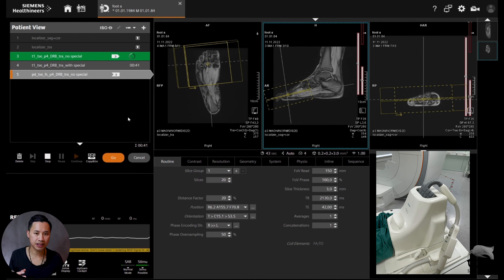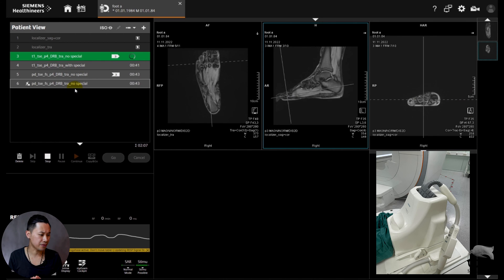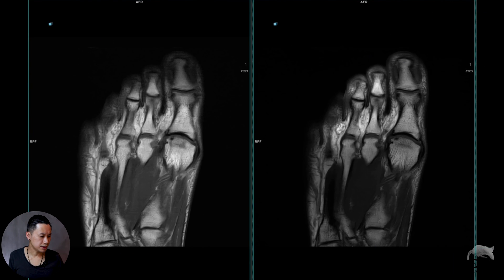We'll try to make the sequences the same and cut down the scan time to make it fast, so we have some images to compare. All right, let's scan those four sequences. So the results on T1 — my healthy volunteer didn't quite lie still with the foot and he was falling asleep.